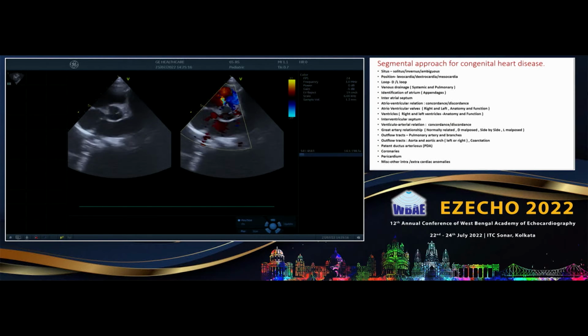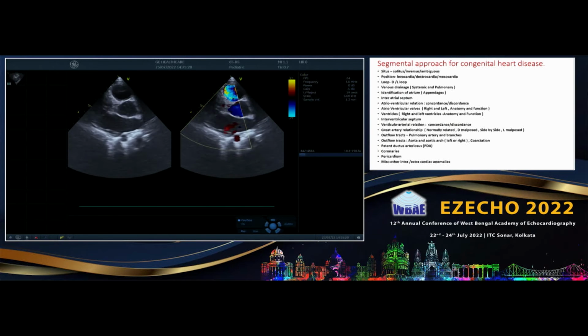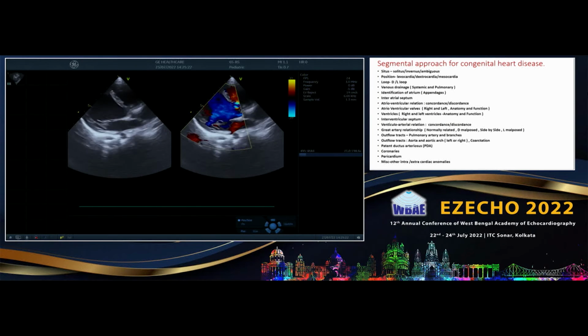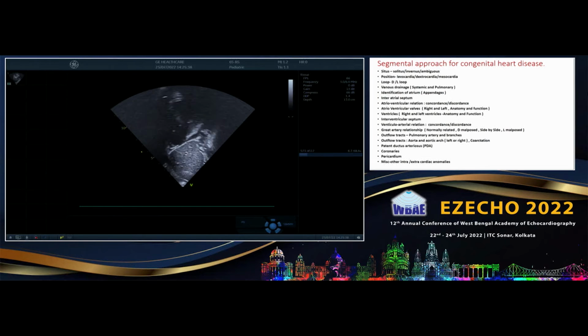In the parasternal long axis view, if we see a VSD immediately below the aortic valve in the regular parasternal long axis view, there is a possibility that the VSD has extended to the outflow septum. Hitting of the VSD jet in the outflow can lead to muscle changes, can cause the Gasul effect. That is one thing. Two associated things: duct, additional VSD, and coarctation. These three things we should keep in mind whenever we are seeing a VSD.